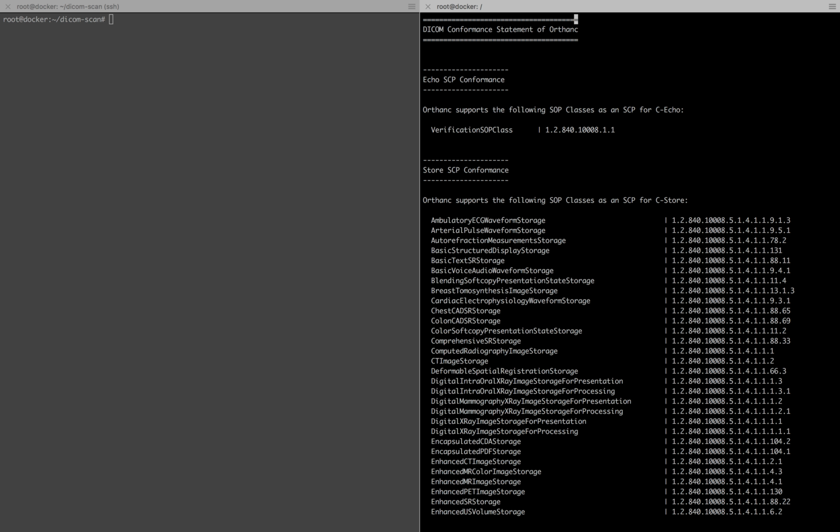A lot of the other researchers that I've looked over, unfortunately, after I read through all this code, and started trying to pick out ways to talk to the application entity title, or identify an application entity title without knowing what the AET was.